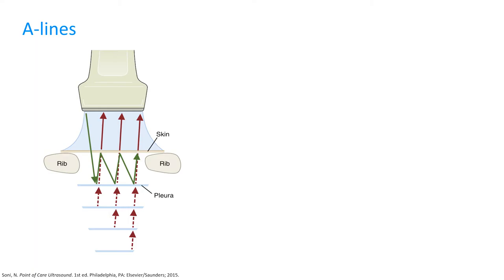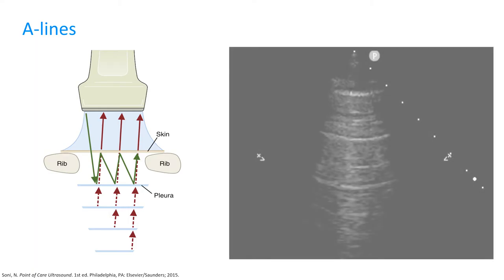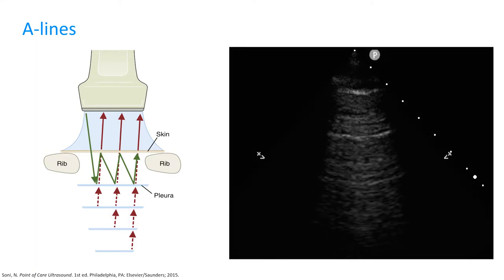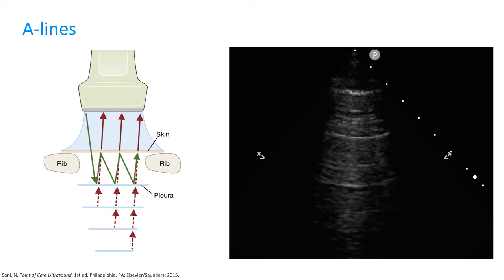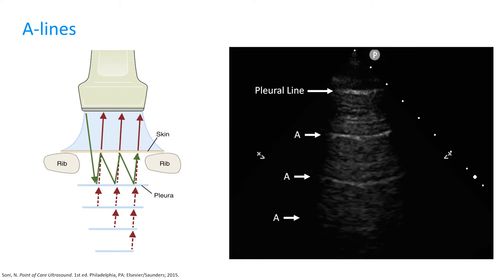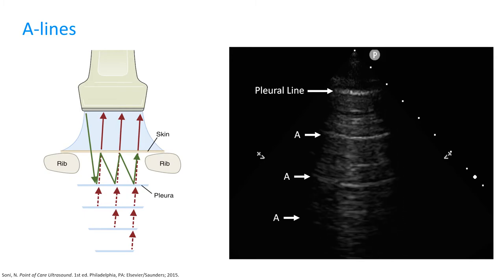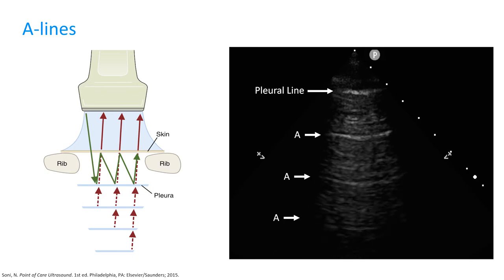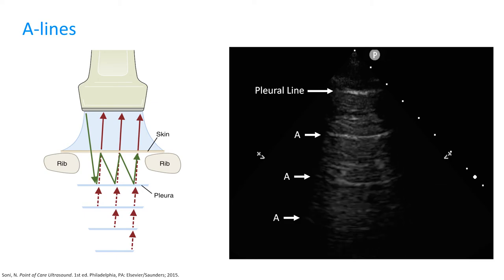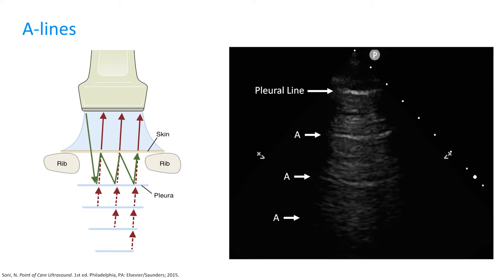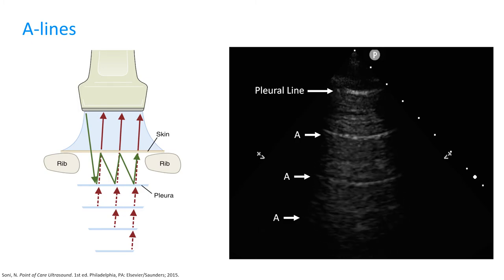This is what real A-lines look like. A-lines are nothing but the artificial repetition of the pleural line below the pleural line. To be valid, A-lines must meet the following criteria: they must be horizontal lines, equidistant from each other, and motionless — that is, they do not move much while the patient breathes in and out. The clinical significance of A-lines is that they indicate the absence of pulmonary edema or consolidations, because if we had either, we would never see A-lines.